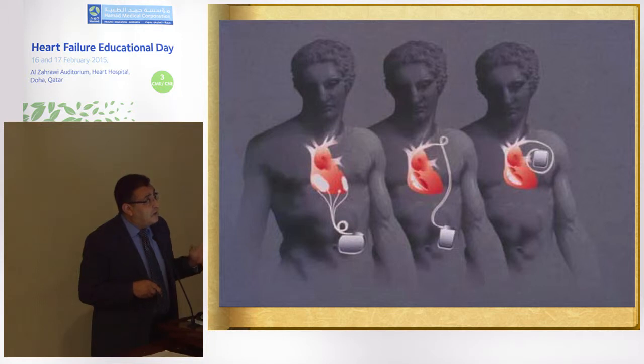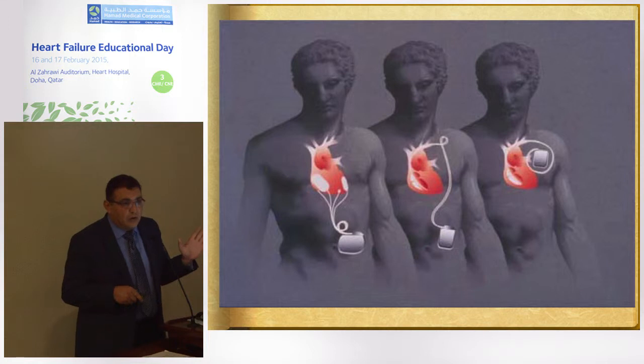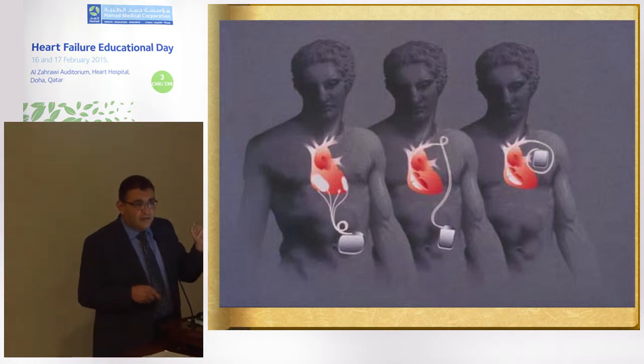Basically, the history goes: the initial technology was for devices to prevent or terminate ventricular arrhythmias or ventricular fibrillation, as a shocking box, basically. Whereas the newer devices are much more advanced now.